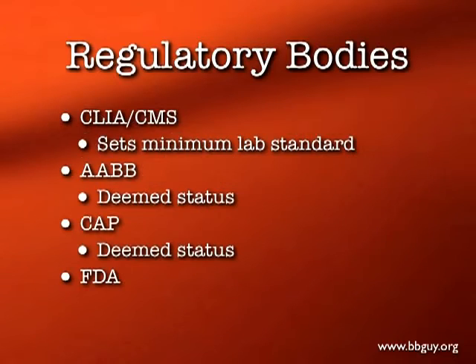As you can imagine, like most things in blood banking, pre-transfusion testing is regulated. CLIA sets the minimum laboratory standard for blood banks and laboratories in general, and also has a few specific regulations surrounding pre-transfusion testing. But honestly, CLIA doesn't tend to inspect laboratories all that much, in particular transfusion services, because there are organizations such as the AABB and the College of American Pathologists that have what's called deemed status, meaning that if you successfully pass, for example, an AABB inspection, you can use that inspection to satisfy the requirements of CLIA. It's not mandatory that you do so, but you can do it.